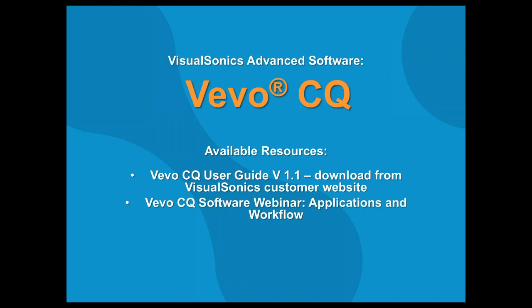And also there's a VevoCQ software webinar that talks about the workflow, how to click through, how to run the software in a bit more detail than we'll have time for today. So if you're interested in seeing that, I'll also have the link at the end of my slides.